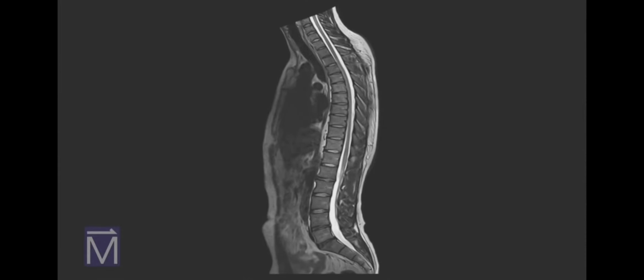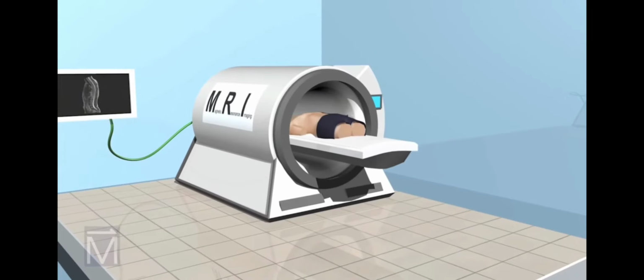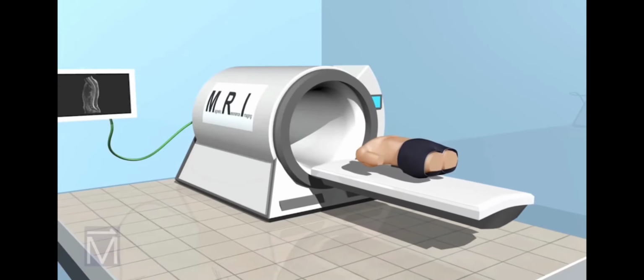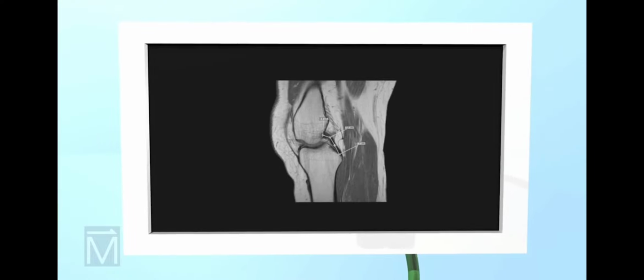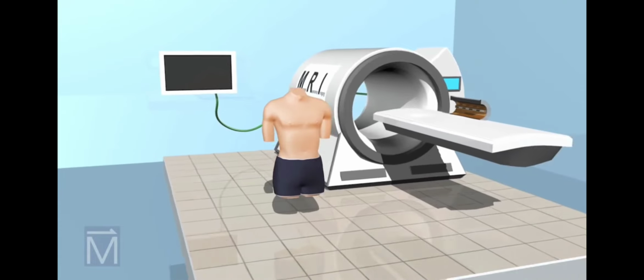Tissue with less water in it will have fewer hydrogen protons to emit signals back to the RF coils. Those areas appear darker on MRI scans. The varying signal strength gets translated into various shades of gray, which radiologists recognize as different tissue on the scan. MRIs can be used to scan the brain, joints, and other parts of the body in order to highlight abnormalities, such as herniated vertebral discs, cancer, stroke, broken ligaments, and aneurysms.